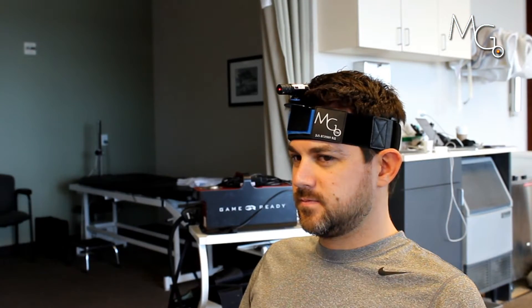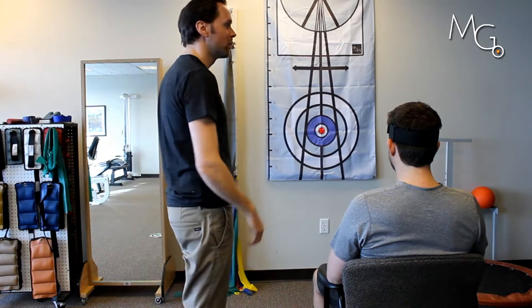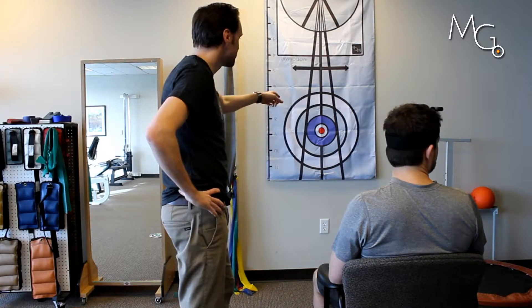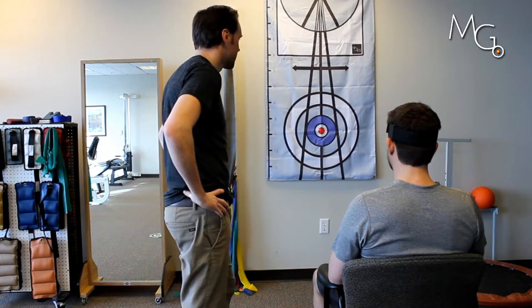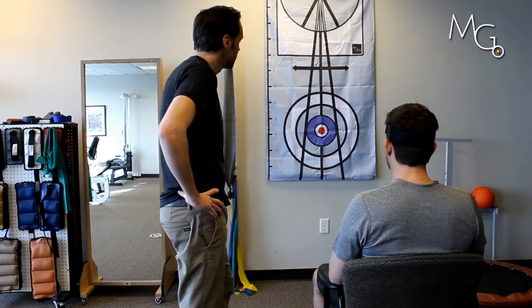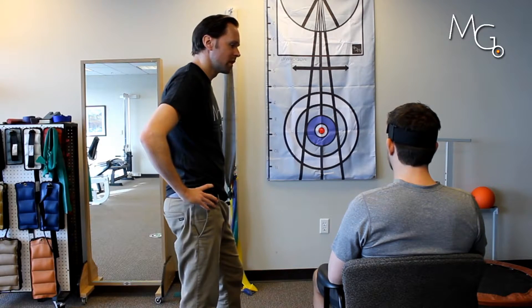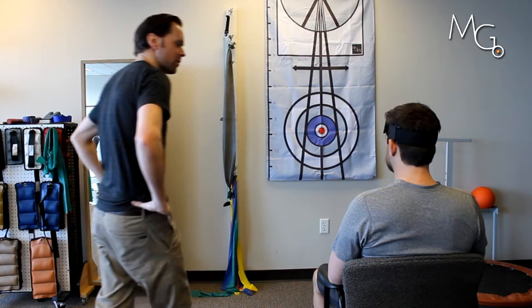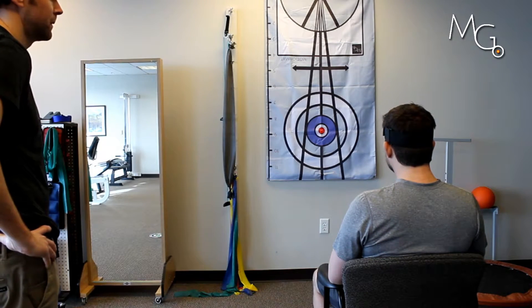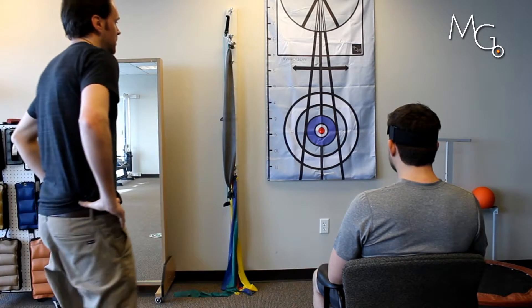Do you feel like you're facing straight ahead at that target there? Yes. I want you to turn your head all the way to the right as far as you can, and then come back to the target. Good — do that a couple of times. Now let's go ahead and do two of those to the left. You can keep your eyes open for now. Turn all the way to the left.